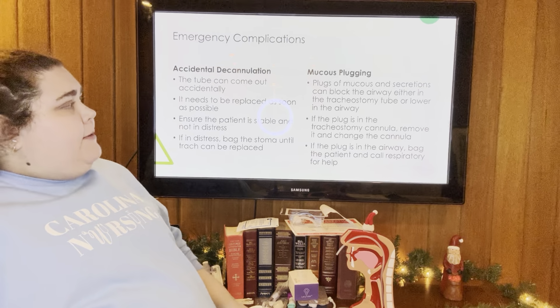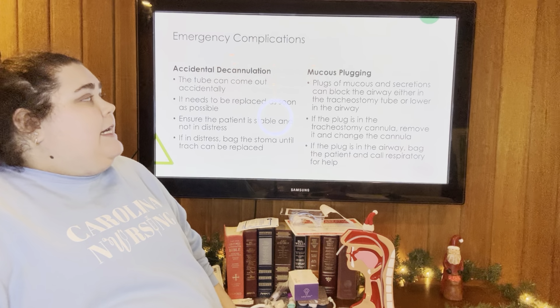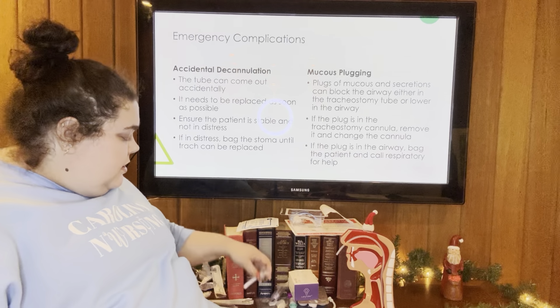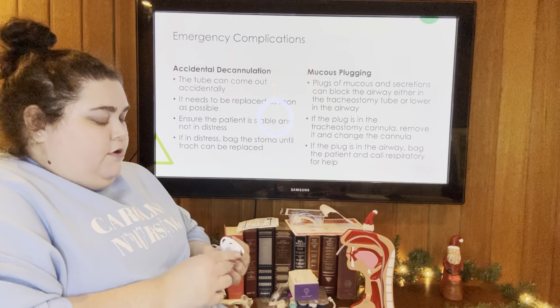So mucus plugging, that is another important complication. So the plug can either be in the cannula or down further in the airway. So if we turn to Tom here, we'll take the trach and put it back in.